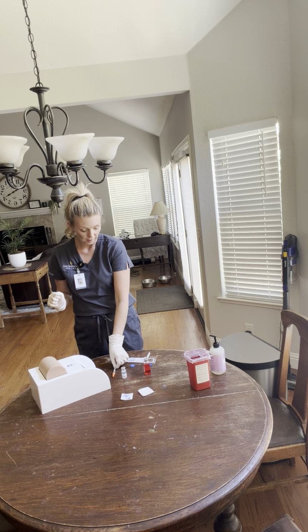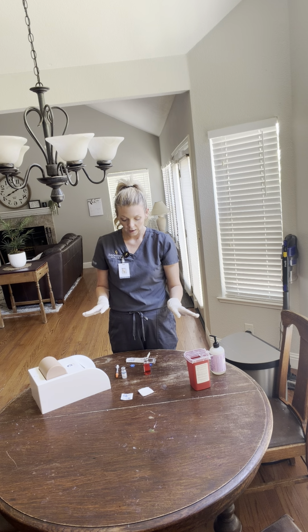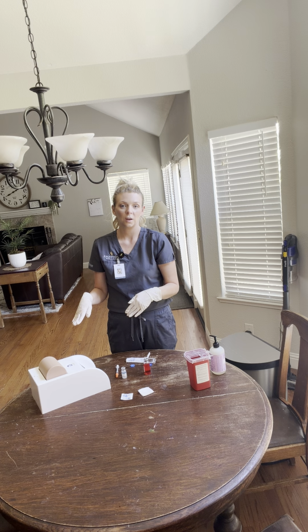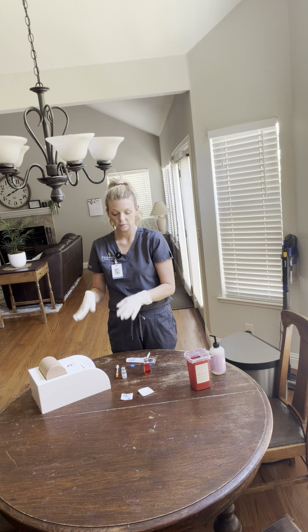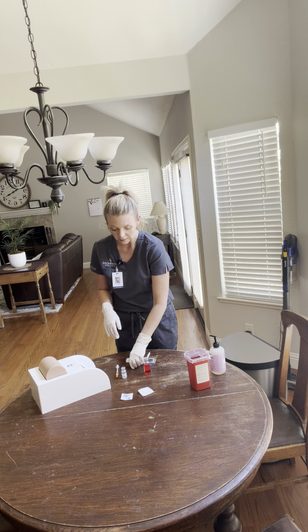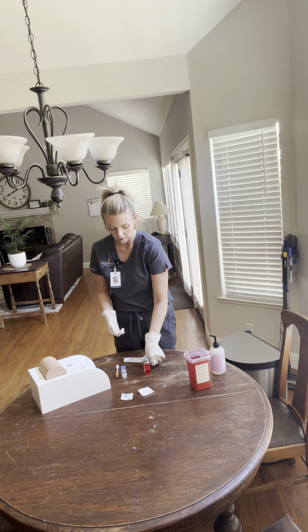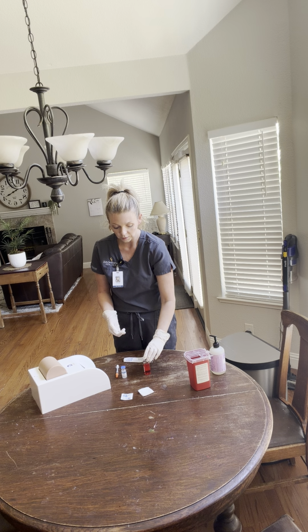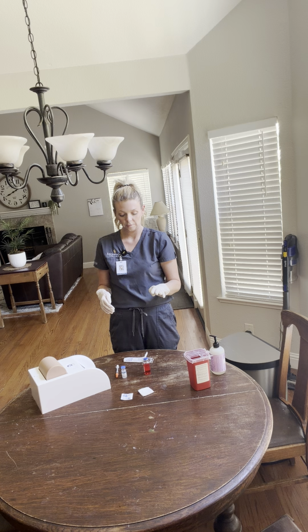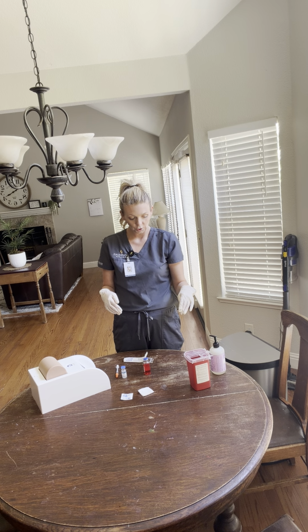We're going to get that done. I'm going to gather my supplies. In this video, we're not injecting the patient per se, but we're going to gather up our supplies. If these medications were not drawn up at bedside, I would label with the patient's name, type the patient's name and the time of dose on each label separately.